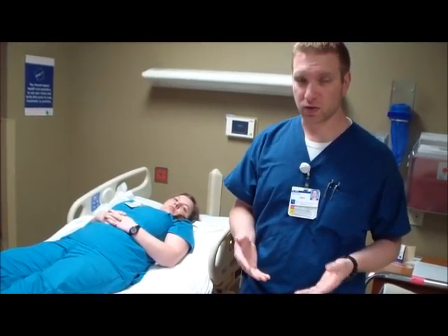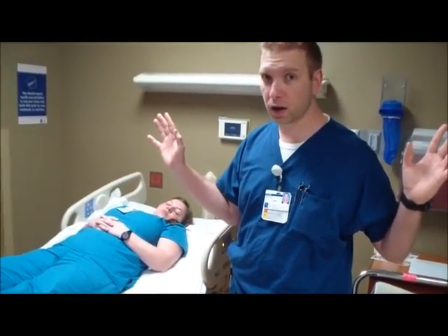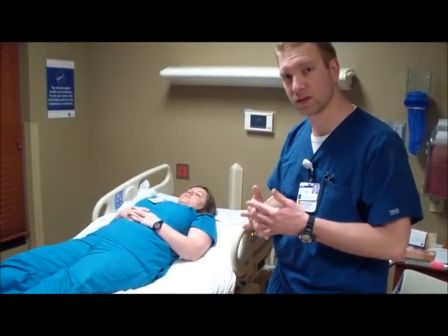Okay, you'll have a lot of patients who are really out of it from medications, or they may be able to lift their leg because they're ready to go. So sometimes you may need to borrow the nurse to help you out if they're really out of it. If not, I can show you some strategies in order to help place a CPM.